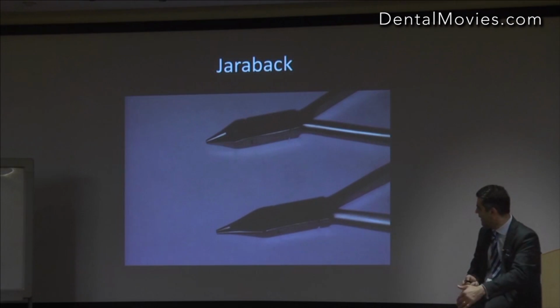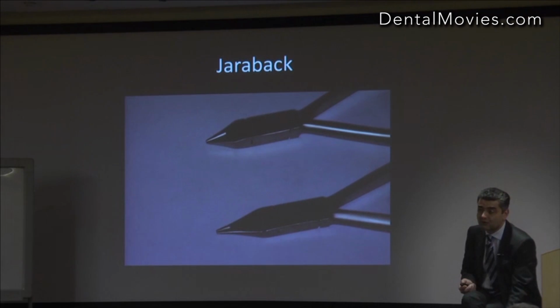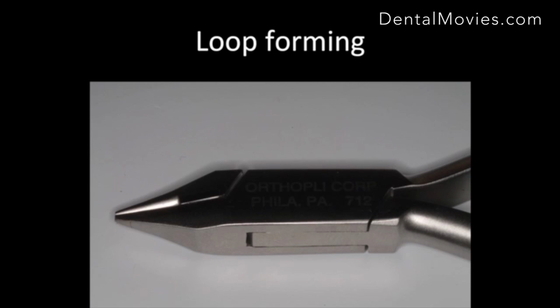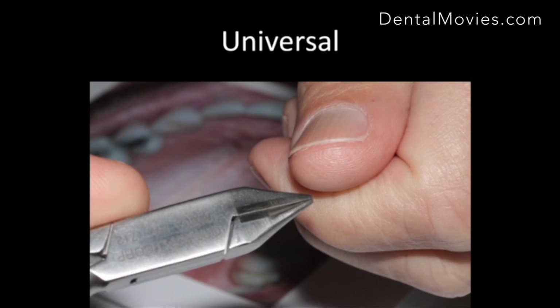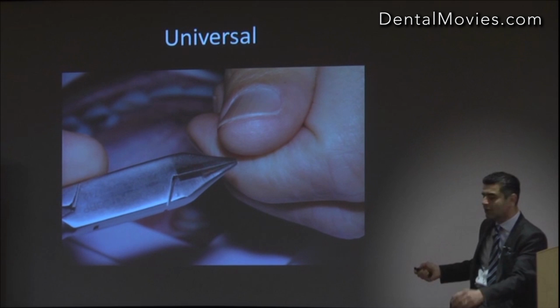It's called a half round, yes? And back in the day, a good wire bender, and I'm going to show you how to do first, second, third order bends with just this plier. So what's the other term for this plier? It's called loop forming, it's called universal, it's called half round. It's all the same plier. It is flat on one side, curved on the other.